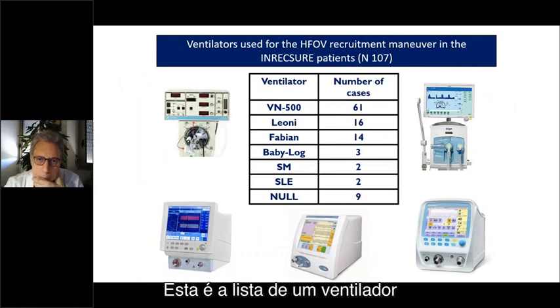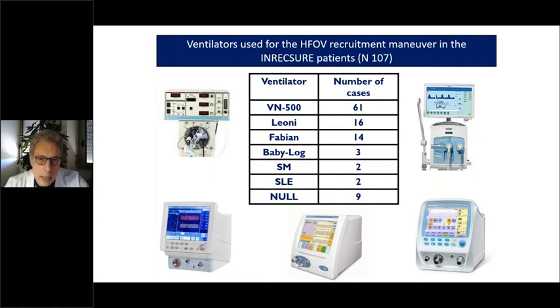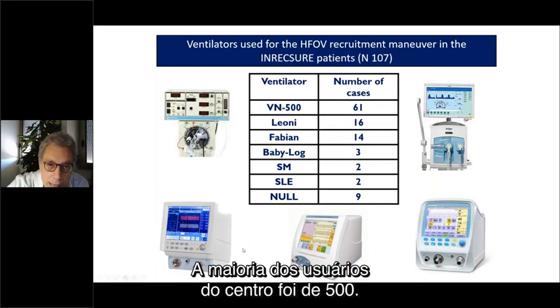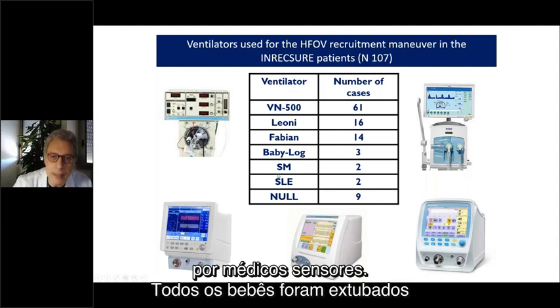This is the list of ventilators used in our multi-center trial. Most of the centers used the VN 500, and only 2 patients received the recruitment maneuver by SensorMedics.